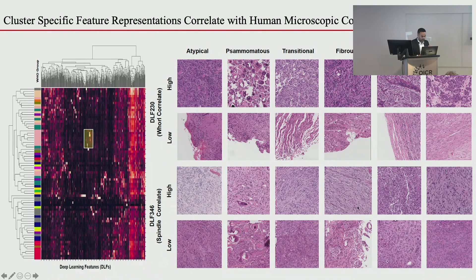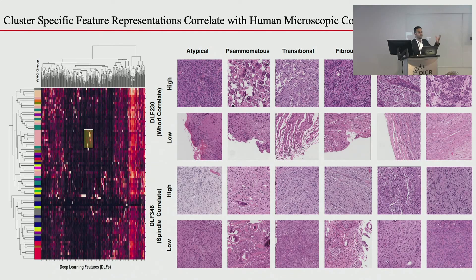Now looking at cluster-specific features: in the meningioma cluster, certain features light up in that cluster alone, with very few other tumors sharing them. These features may have human-understandable correlates in how humans group meningiomas. Using feature 230 — one of those cluster-specific features — the high-230 tiles show tumor cells whirling, forming whorls, which is the classic diagnostic feature of meningiomas. Atypical and psammomatous subtypes form calcifications because the whorls are so tight.